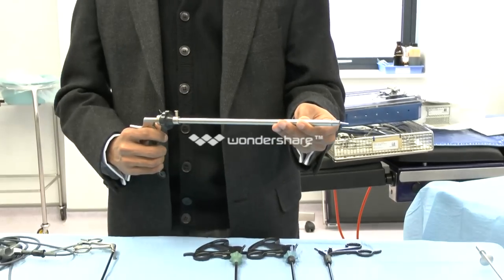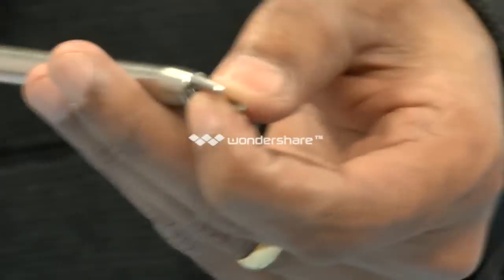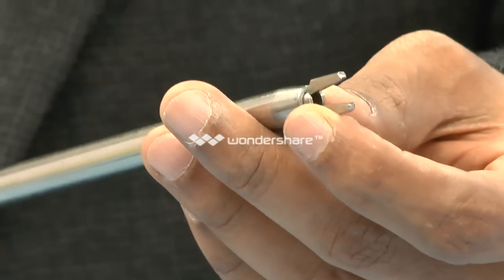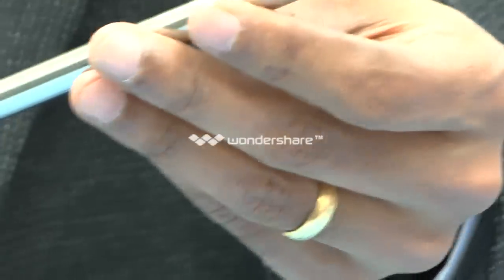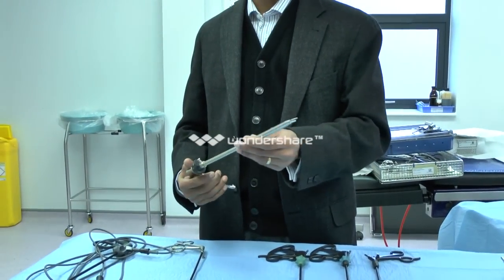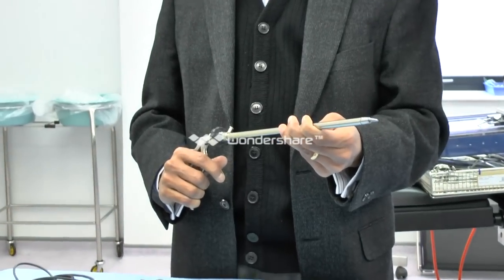This is a clip applicator — not very commonly used by gynaecologists but quite useful. For example, you can clip the uterine arteries temporarily during a myomectomy to reduce blood flow to the fibroid. It is also used by general surgeons to apply clips onto the cystic duct and cystic artery during a laparoscopic cholecystectomy. A very useful instrument.